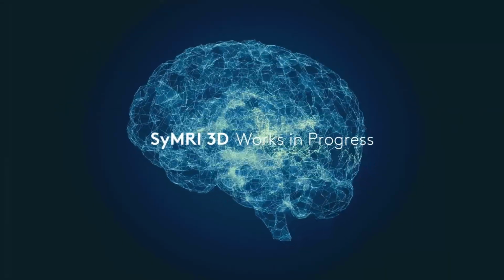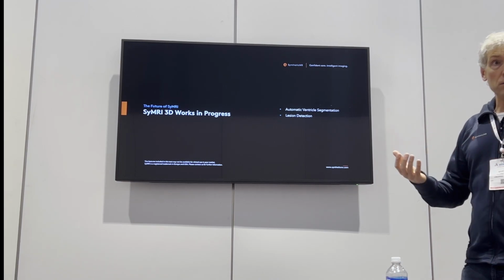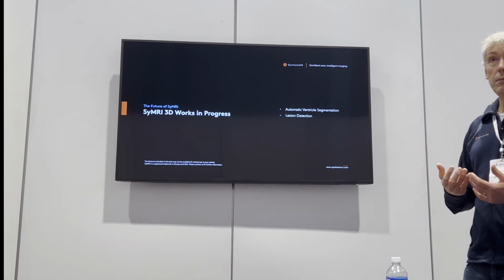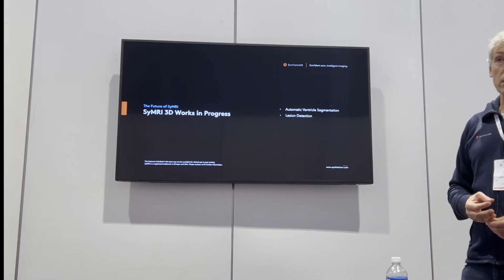Next. Finally, the thing that is a bit more interesting, because 3D opens up a whole new realm for us, where we couldn't go with the thicker slices solution. Even though the volumes are the same, we now get a much better grip on the irregular shapes and on the smaller structures that we want to go to.